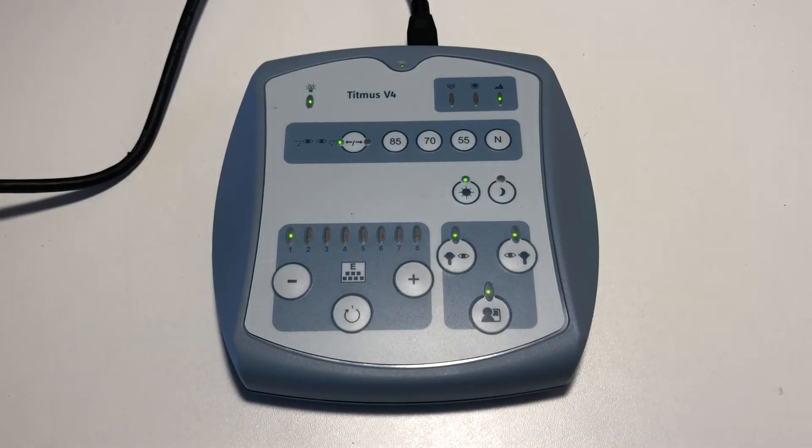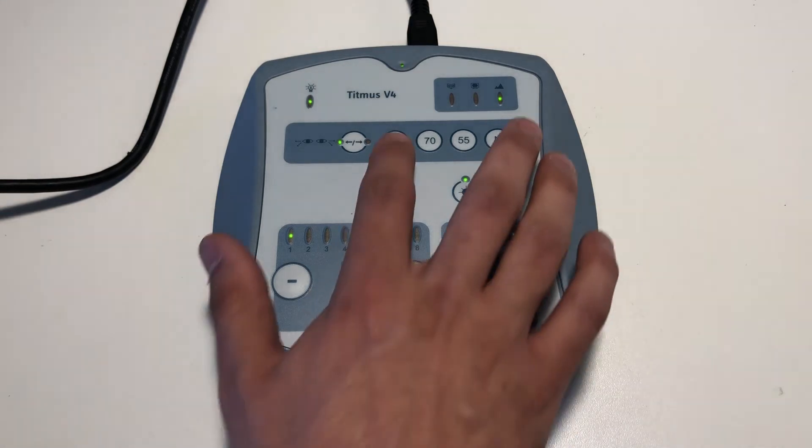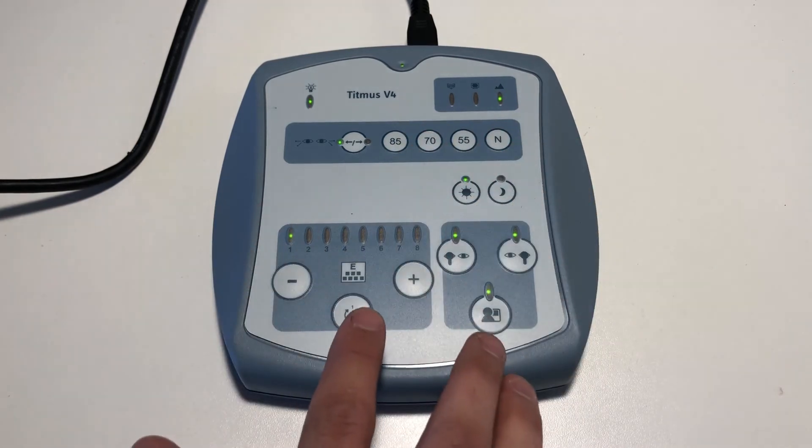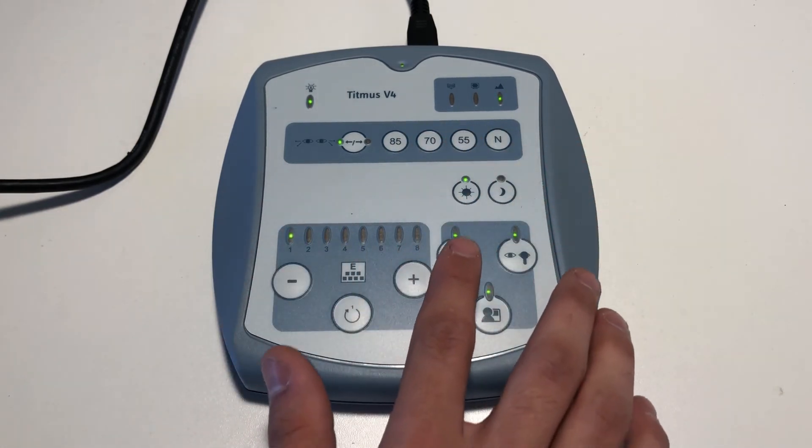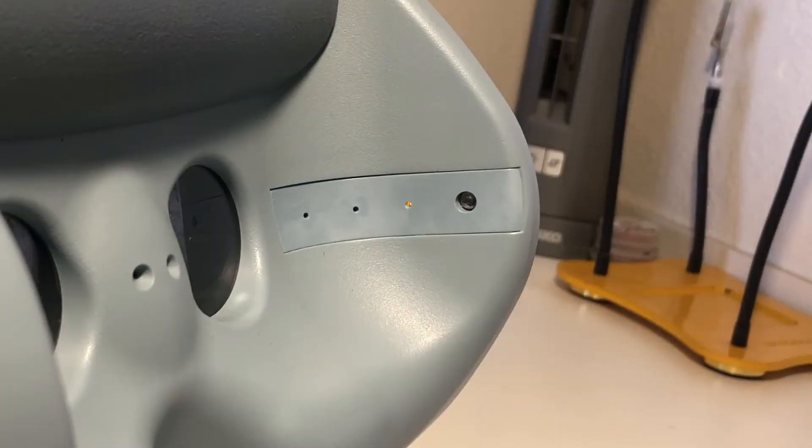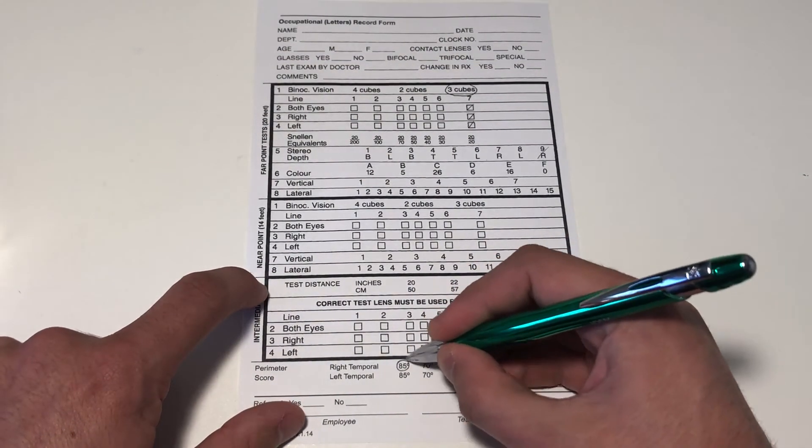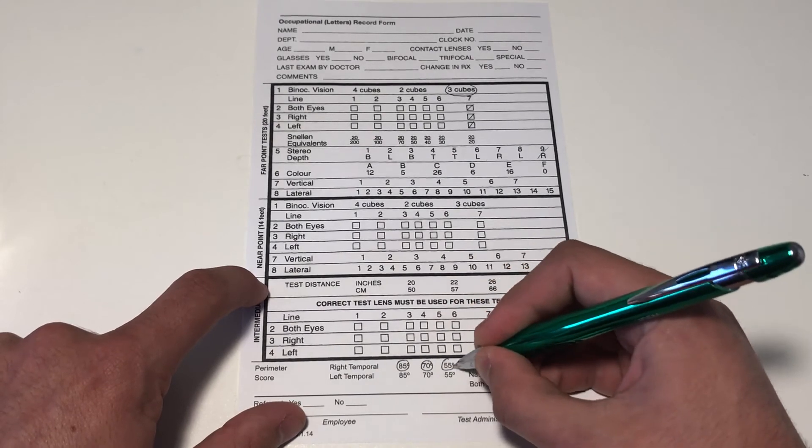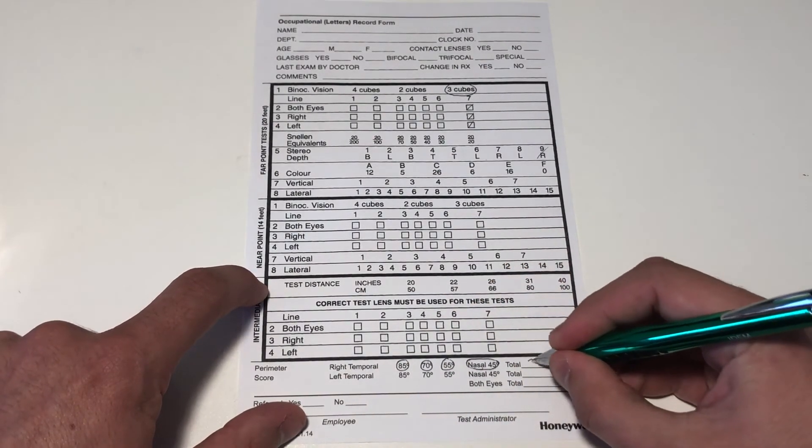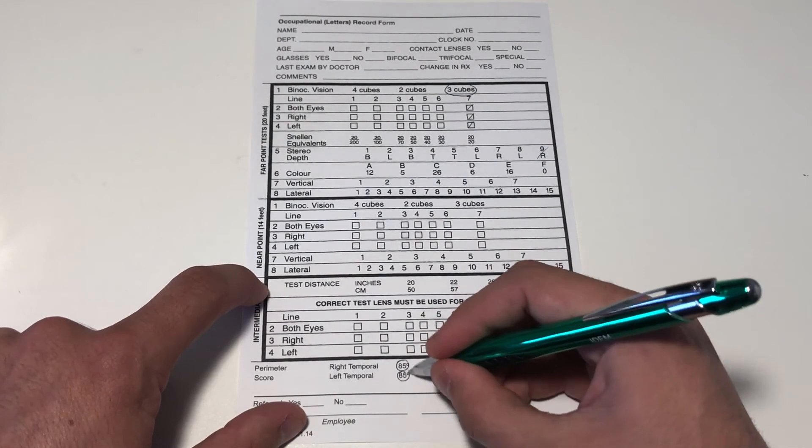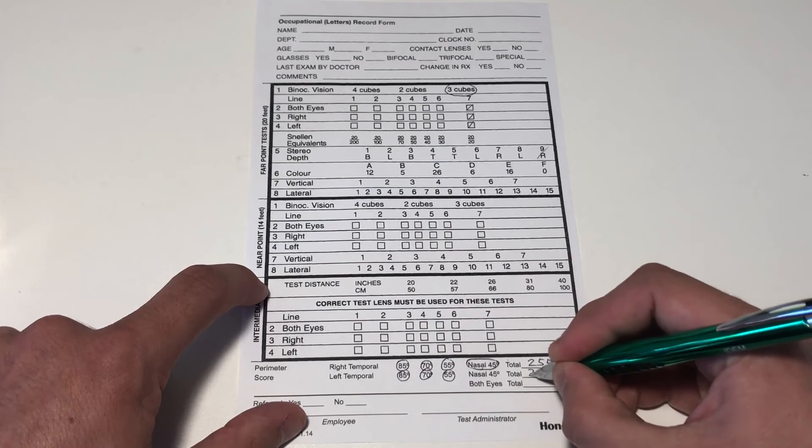Advance the slide back to number one. Here we will be testing for peripheral vision. Ask the patient to raise their hand each time they see a light flash. We will test for temporal vision at 85, 70, and 55 degrees, as well as a nasal test at 45 degrees. The patient must see all lights in order to pass. On the record form, we record the results by circling each light the patient was able to see. We tally the results by simply adding the degrees up. The passing score will be 255 for each eye, or 510 total.